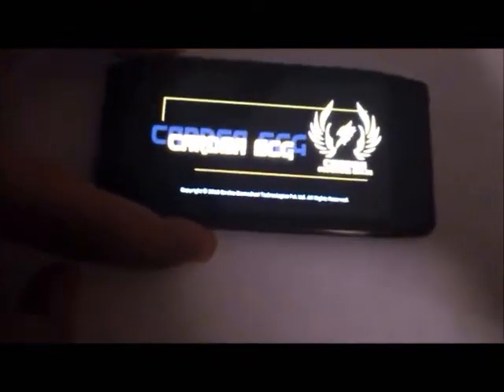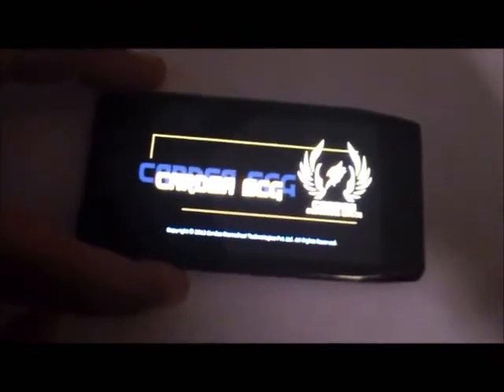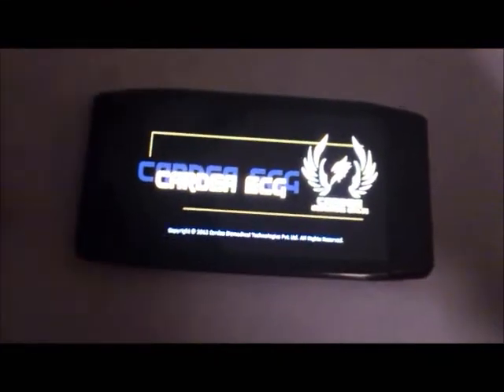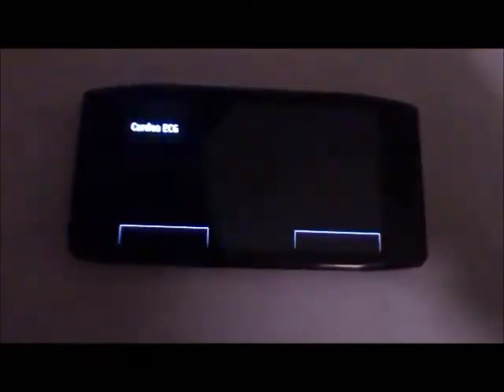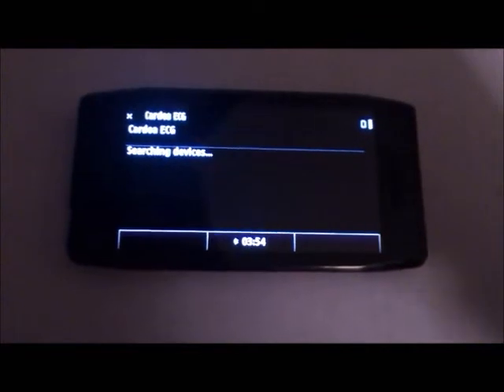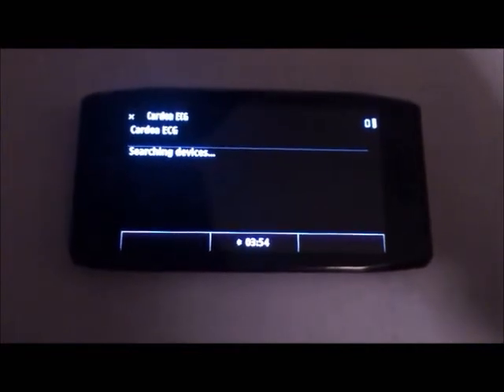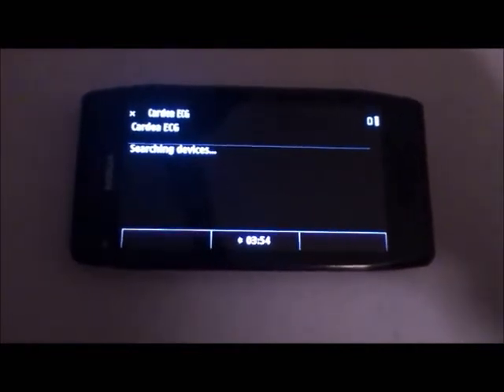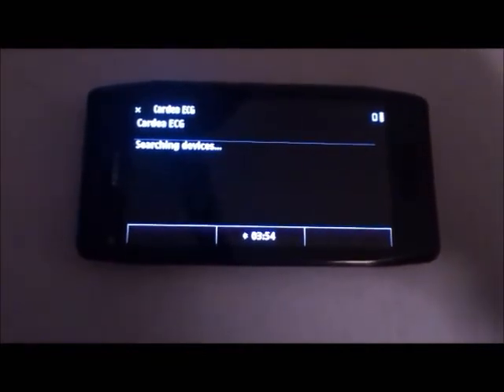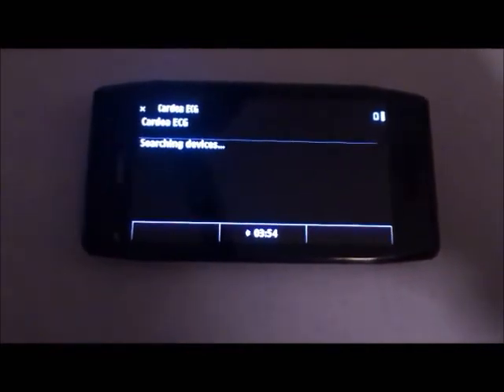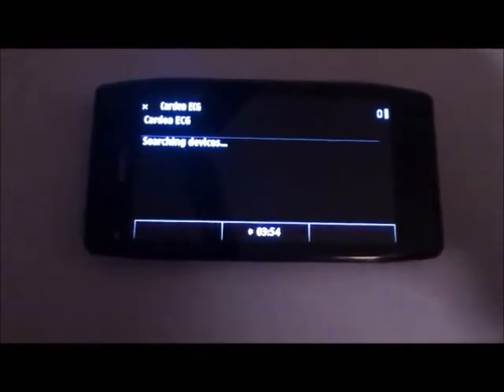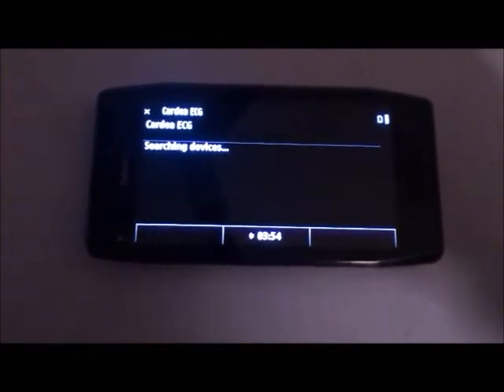This is the mobile app. As we can see, the mobile app first searches for any Bluetooth devices in the vicinity.